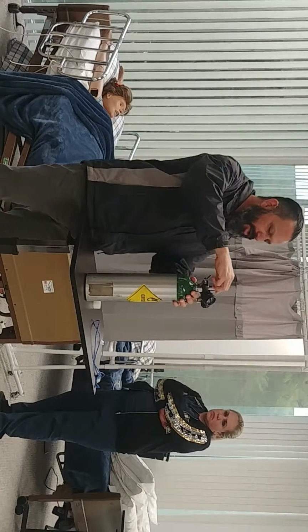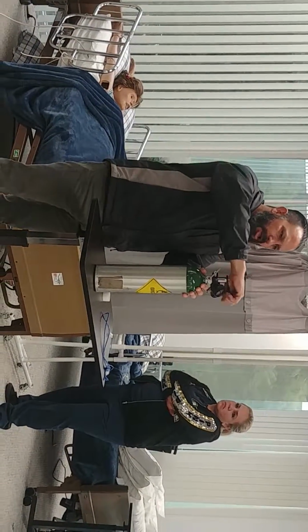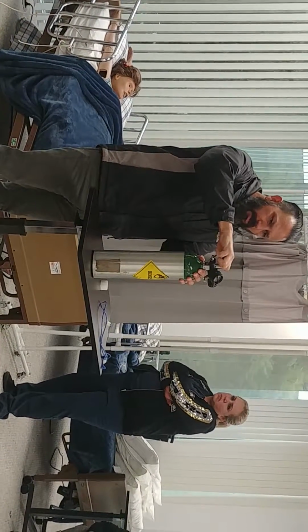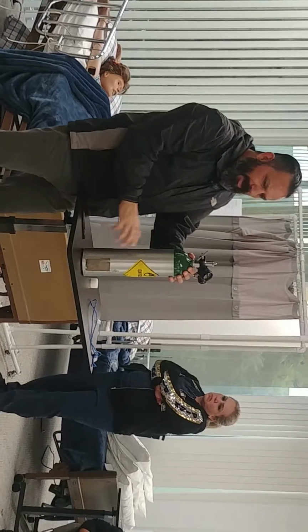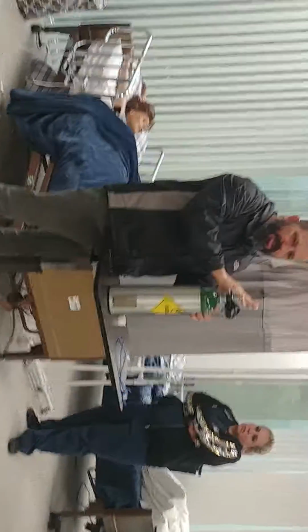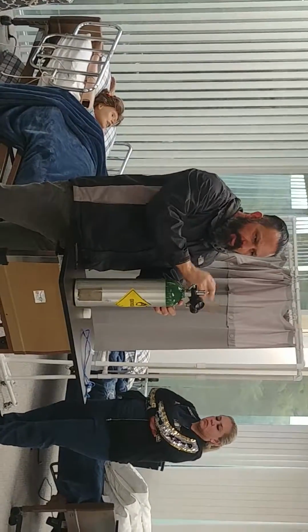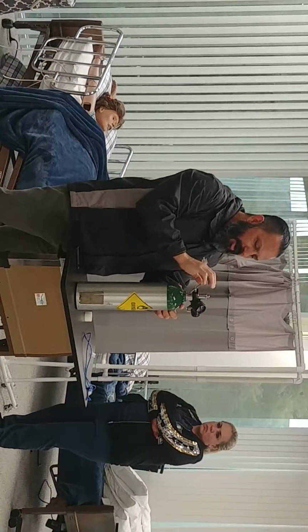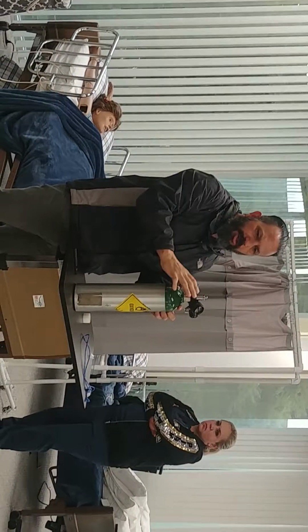So we're going to close the main system itself. Now remember, we've already gone from here to here in this system, so there's still some residual pressure here in this regulator. So we shut it off from here to here, but this residual needs to be drained.